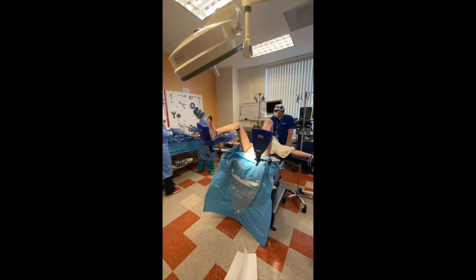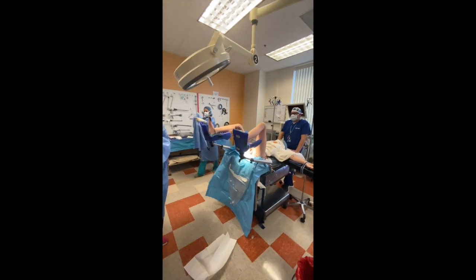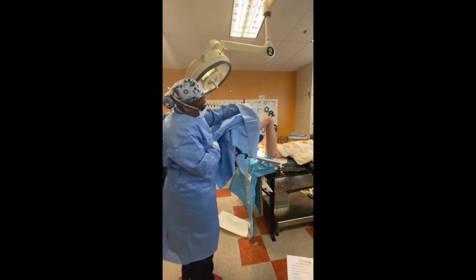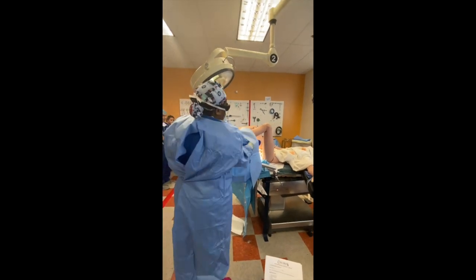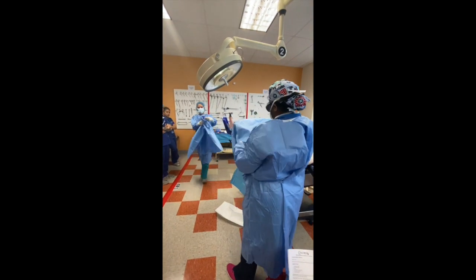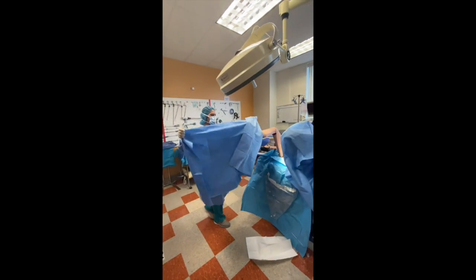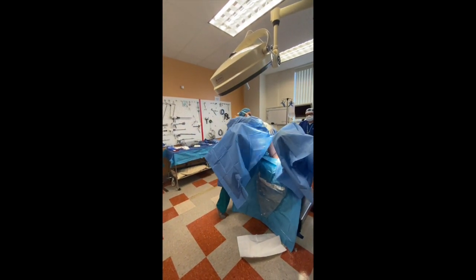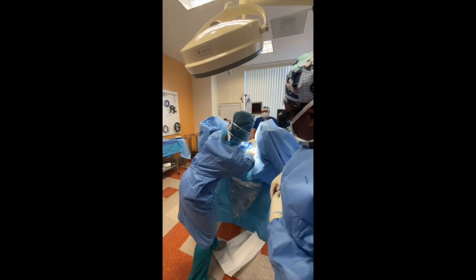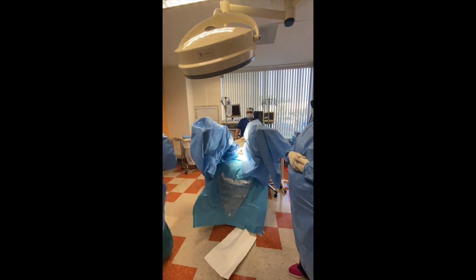Apply sterile leggings extending over the stirrup and patient's legs. She's on the outside — that's where I'm going to be. Open the mouth of the drape — I call it the mouth of the drape. Get it up on there. I'm still controlling this side and then I drag that forward. Done. Making sure that's all prepped — it's okay that that touches. It's prepped to sterile, surgically clean to sterile.